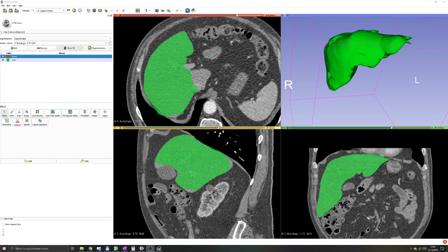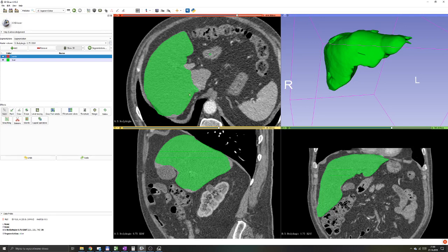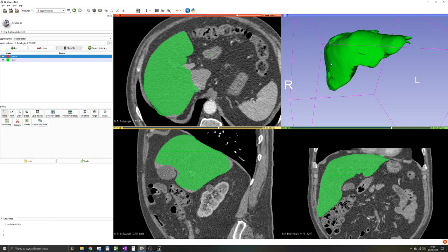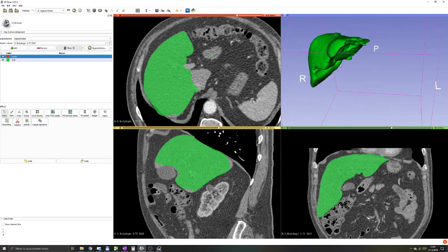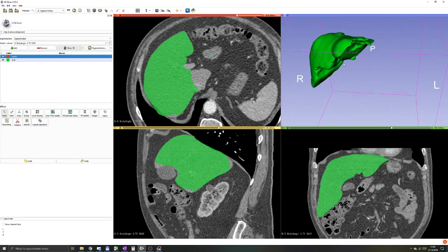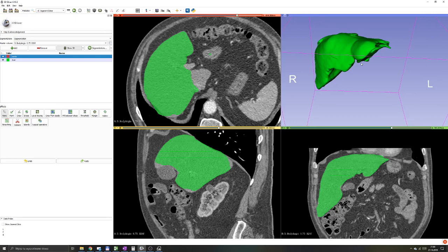A very important thing to understand when working with medical image processing and specifically 3D imaging is the difference between surface rendering and volume rendering. Surface rendering is basically performing a segmentation and then making a 3D model out of it. This 3D model is a mesh that you can export as an STL file and 3D print. This is surface rendering.